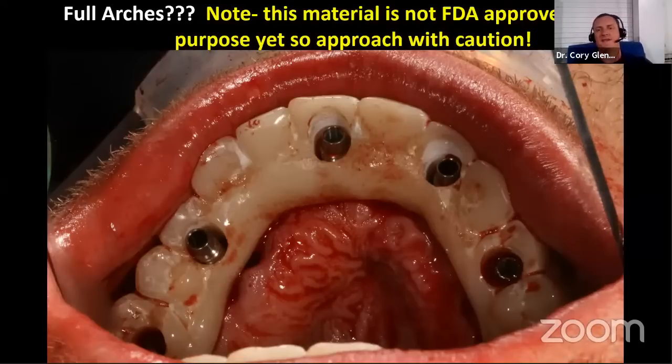And so this is right after placing the implants and putting temp cylinders on. And again, everything lined up perfectly. The cylinders were right in the middle of the hole.